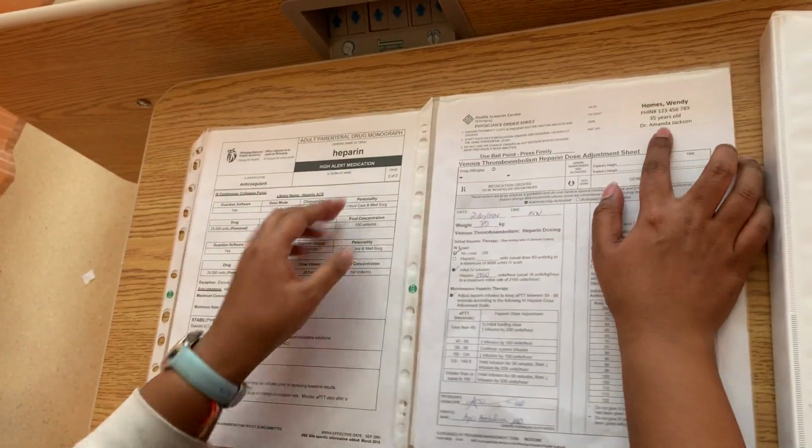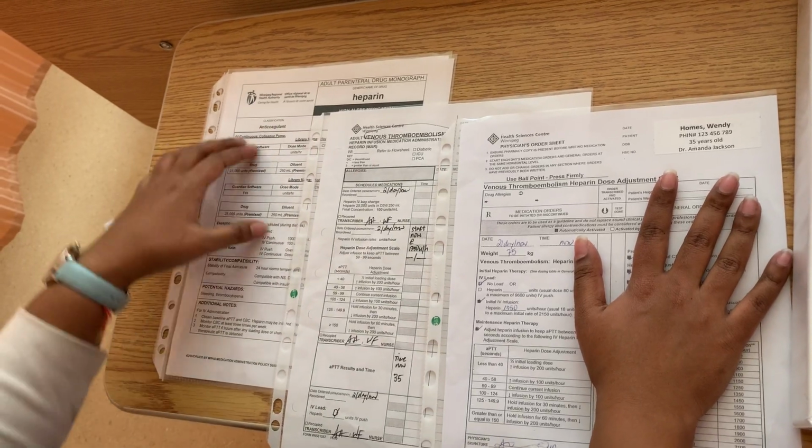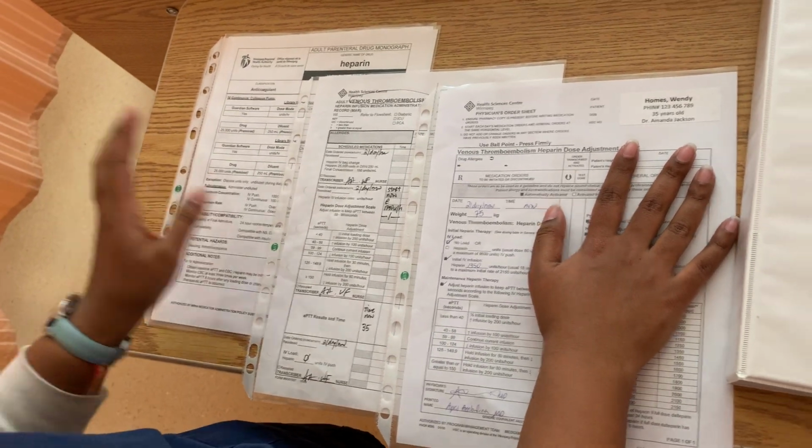I'm going to be doing continuous heparin and a chest tube dressing change. So I'm going to do my first check here. I'm going to be comparing my doctor's orders to the MAR, and I have the PDM for IV continuous heparin I've already looked over.